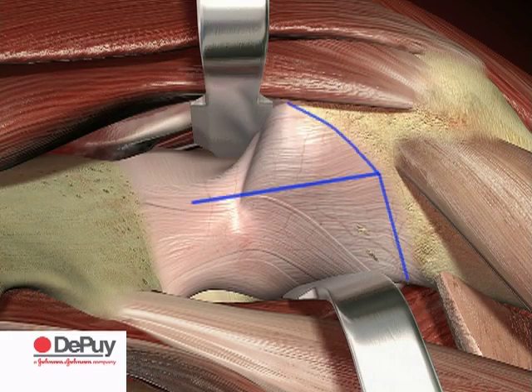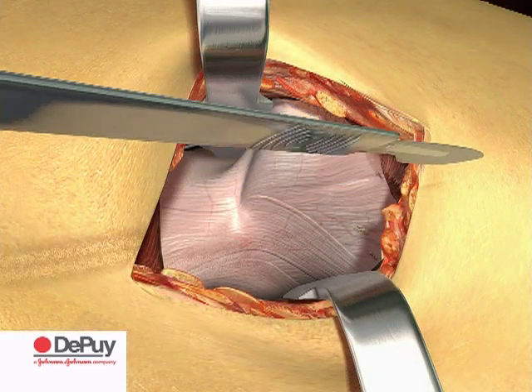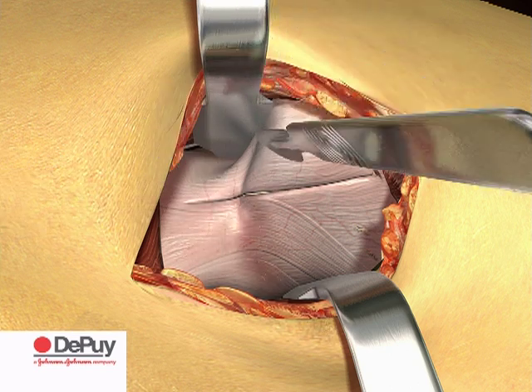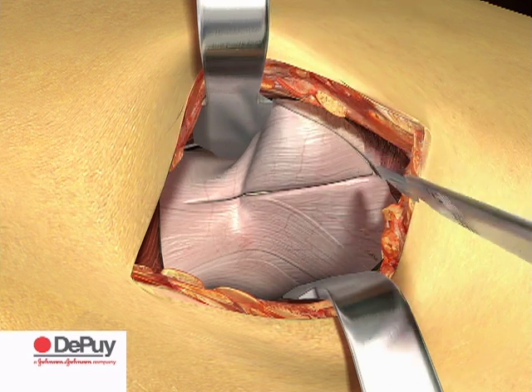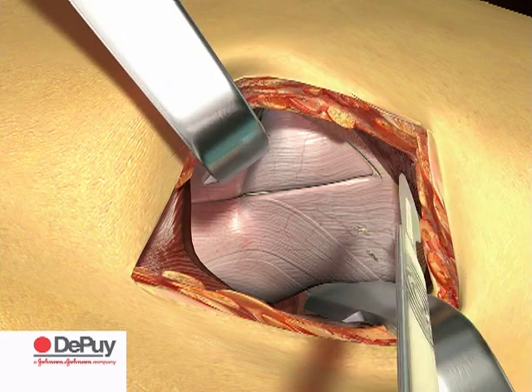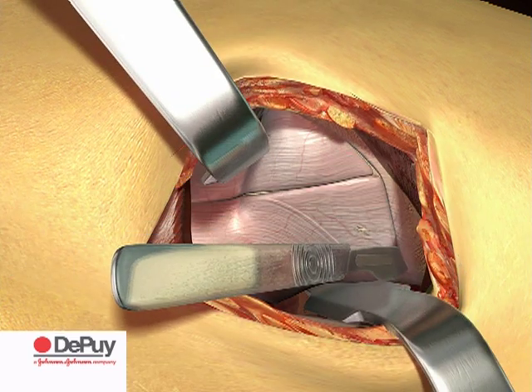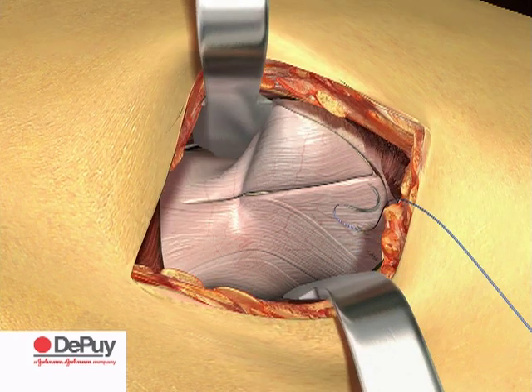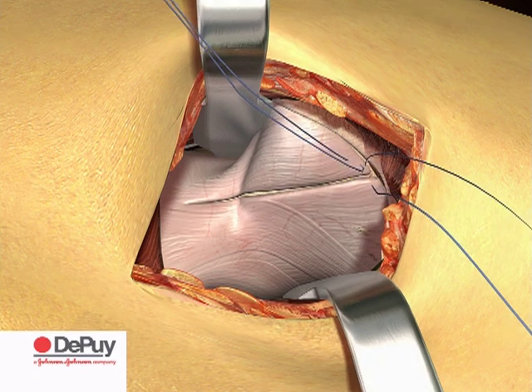Make a T-shaped capsular incision, inferior to superior and along the border of the greater trochanter. Lift the capsule away from the bone using a rasp if necessary. Suture and reflect both flaps ready for reattachment.